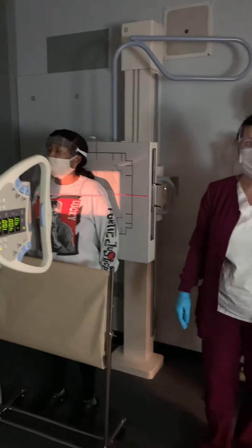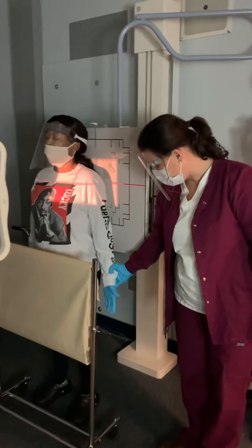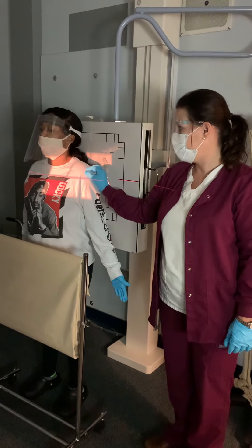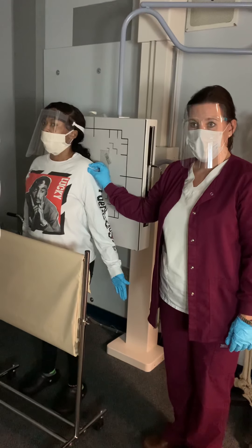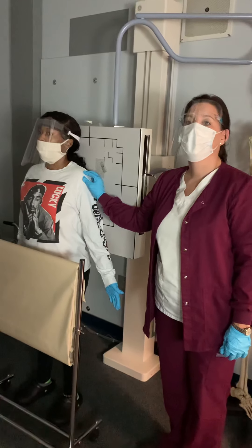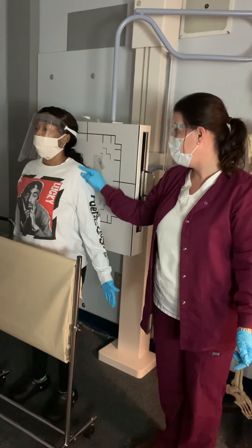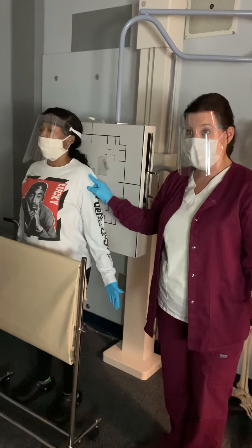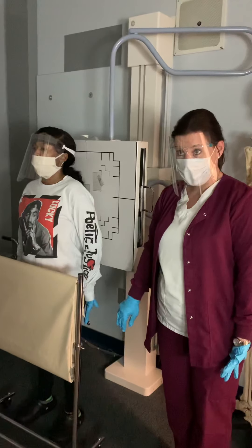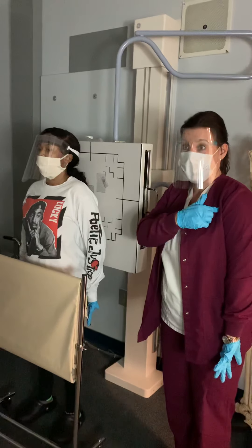So that is internal rotation. What's happening when she is in external? Remember with the AP humerus, what's going on in the proximal humeral area? The greater tubercle is in profile — that means you can see it sticking out. When she turns her hand into internal rotation, it brings the lesser tubercle into profile, but it's medial.